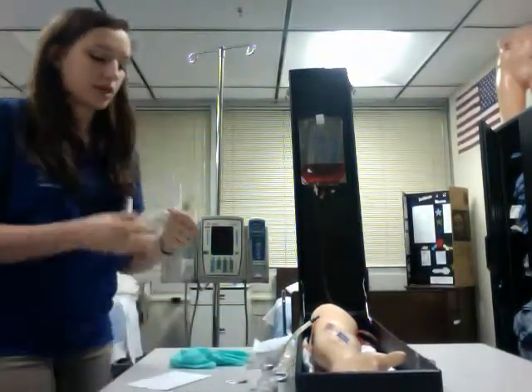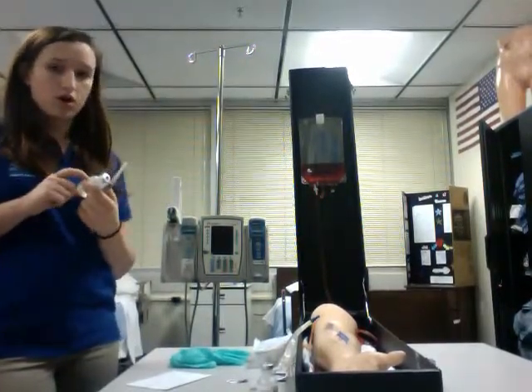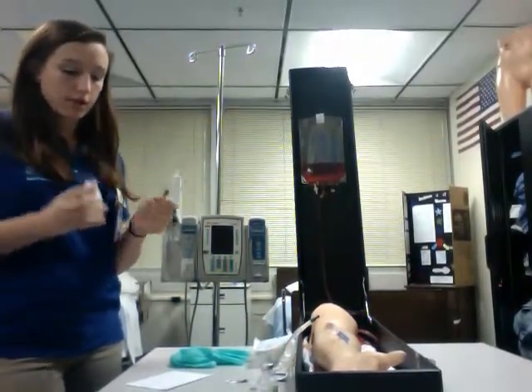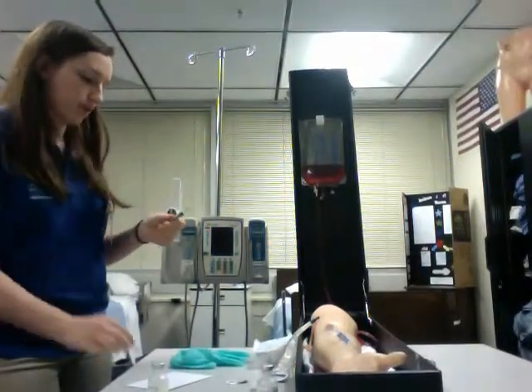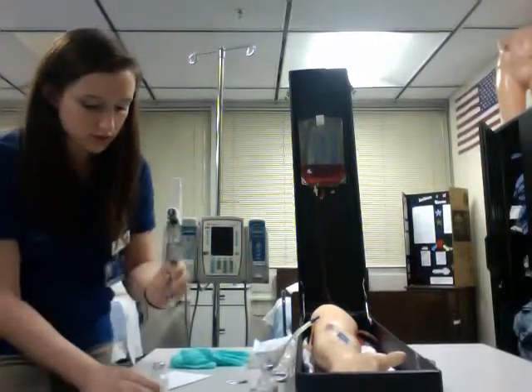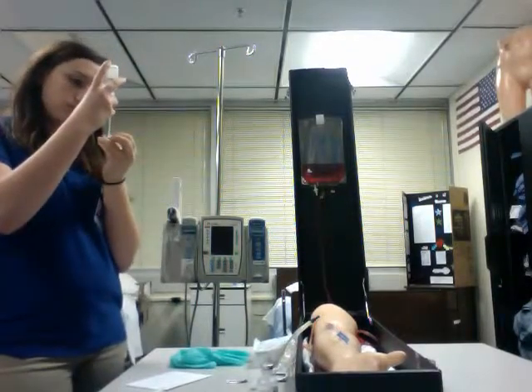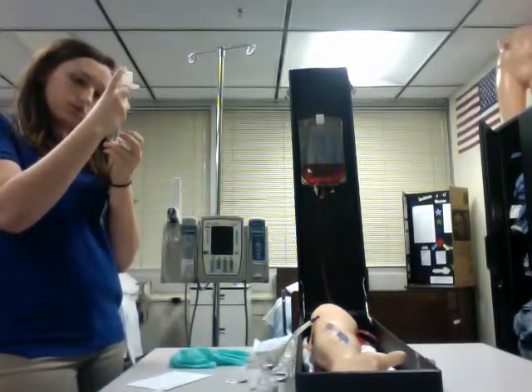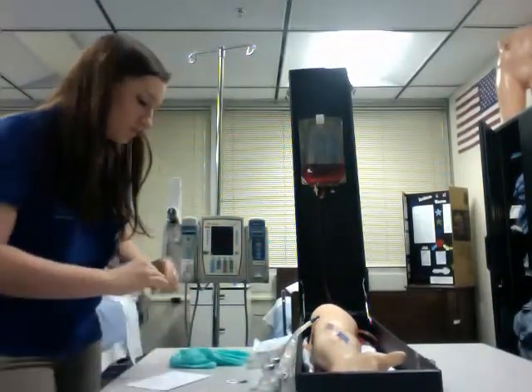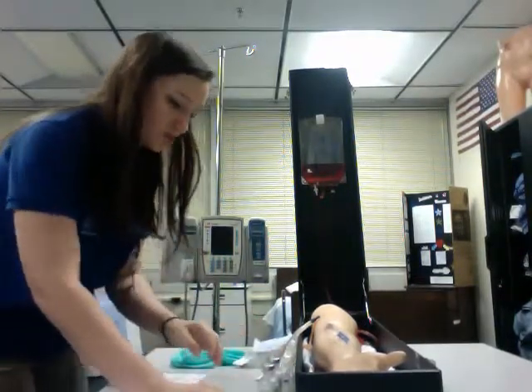Since my medication is 500 milligrams or 1,000 milligrams per milliliter, I'm going to draw up half a milliliter for 500 milligrams. I'm going to check the expiration date, and I see that it's not expired yet, so I'll go ahead and pull up half a milliliter of air. Okay. And then I'm going to recap my needle. Okay, so now I have everything ready to go into the patient's room.